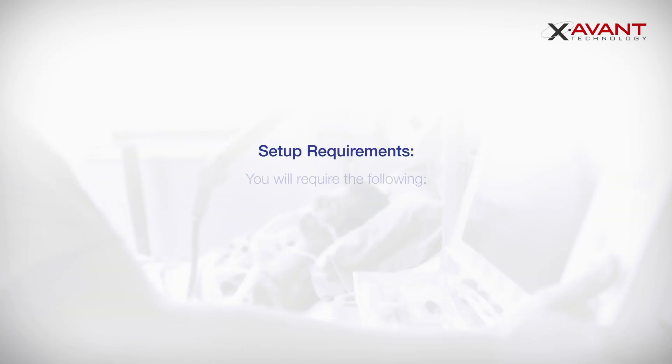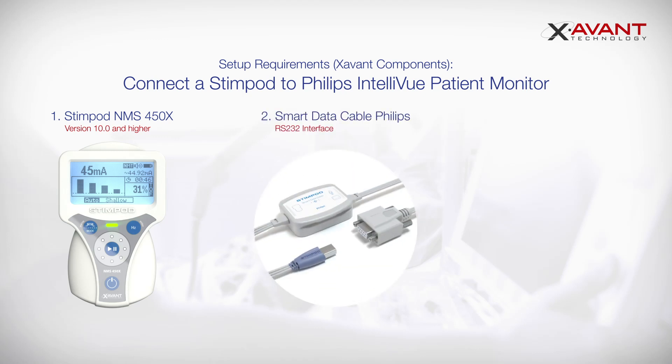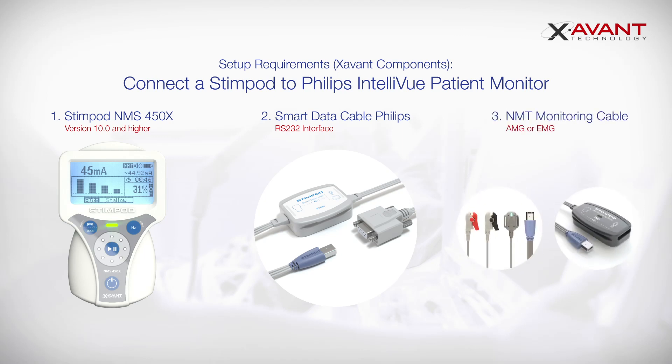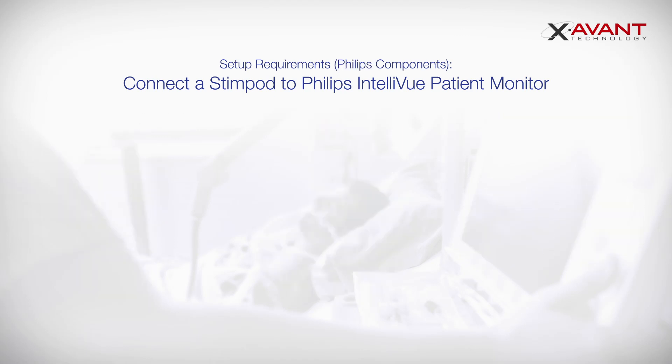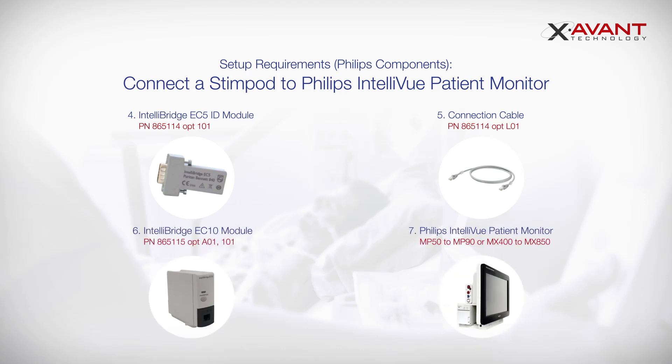Setup Requirements. You will require the following: your Stimpod NMS450X Stimulator with software version 10 or higher; Smart Data Cable Philips with an RS232 interface; NMT Monitoring Cable, AMG or EMG; a Philips EC5 Module; a Connection Cable; a Philips EC10 Module; and a Philips Intelliview Patient Monitor.